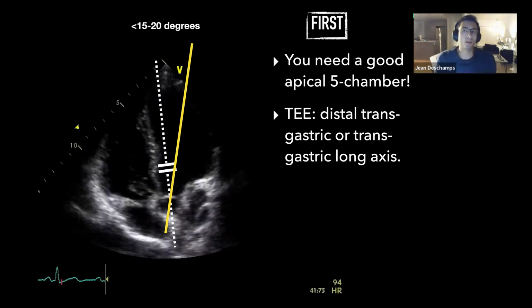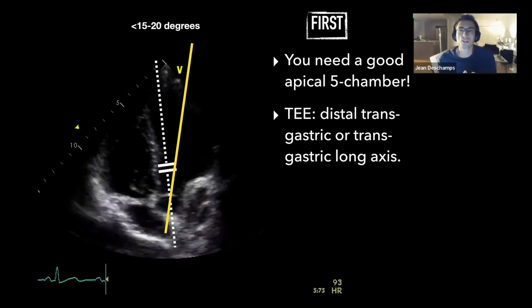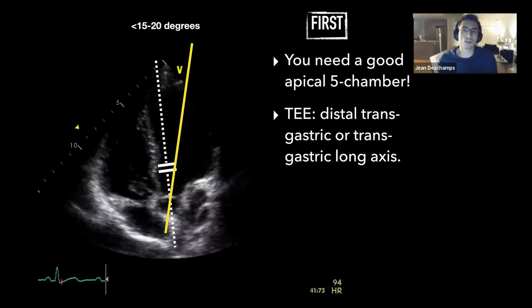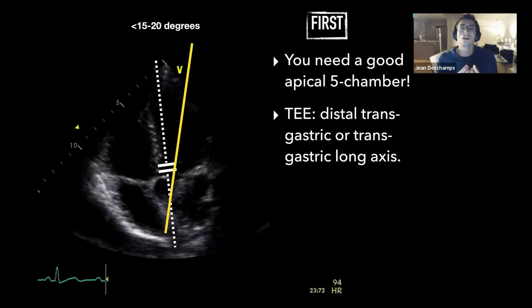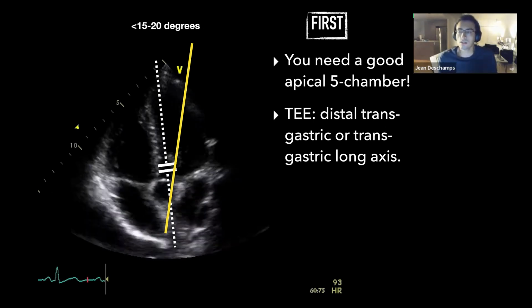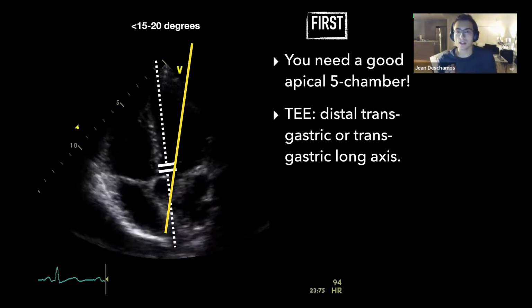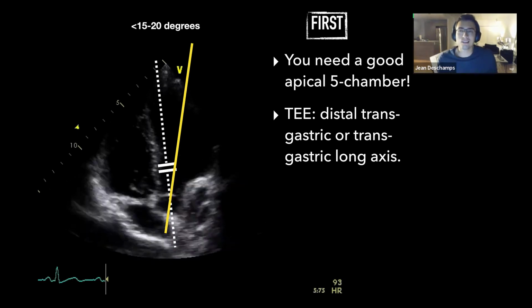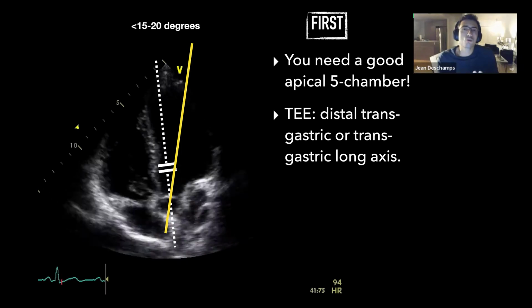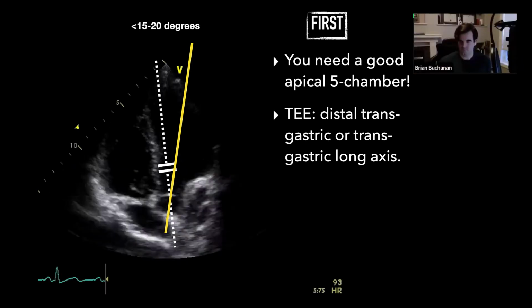Less than 30 is probably fine for most of our critical care applications because we don't need as precise a number. We are not determining whether a patient needs surgery or a valve replacement, which is the job of the echo lab. Our job is to estimate a gross cardiac output with VTI, so a precision of a couple hundred cc's is probably not the major concern.